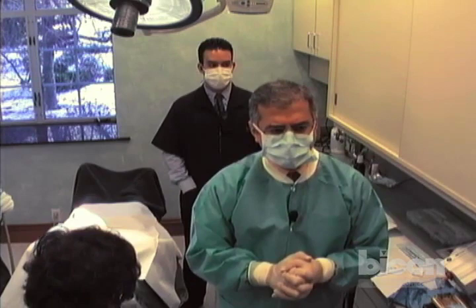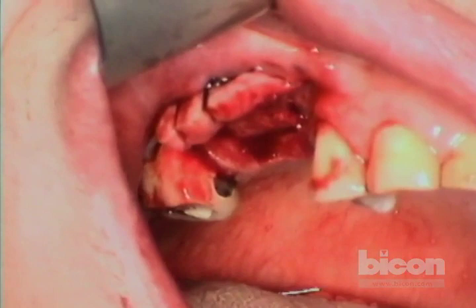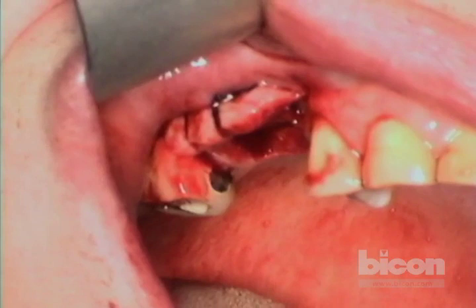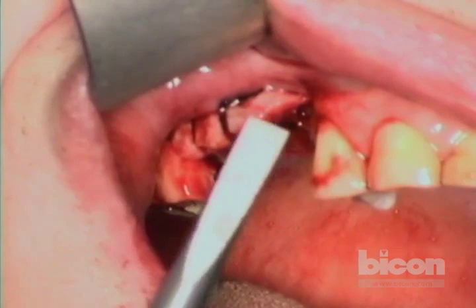Now I need to do a floor window for the floor transport osteotomy, for which I need my ridge-split osteotomes. The idea is to place a six-millimeter-wide implant, so we have to make the sides of the rectangle — the narrower sides — less than six millimeters wide. The easiest way for me is to use a chisel that is less than six millimeters, so I use the width of this osteotome to make the rectangle.